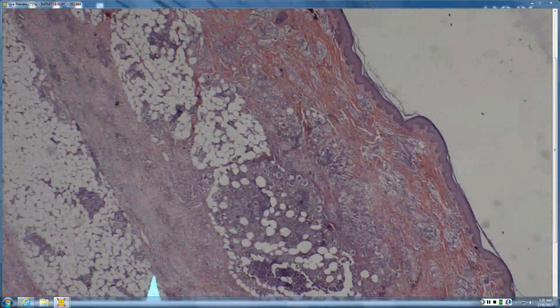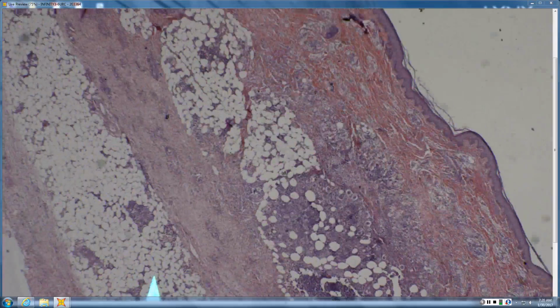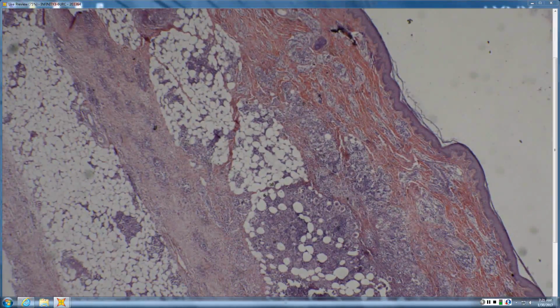So this one was listed as Erythema nodosum leprosum, and that's the type 2 reaction to leprosy. From scan, you have this infiltrate that's perivascular, but also deep, kind of in the subcutis. Also, almost in the fascia, you have some thickening of the fascial layers. I'll get a little closer in, but you can almost see from scan there's something going on around this entity, which is a nerve, and that's the onion skinning fibrosis that occurs.